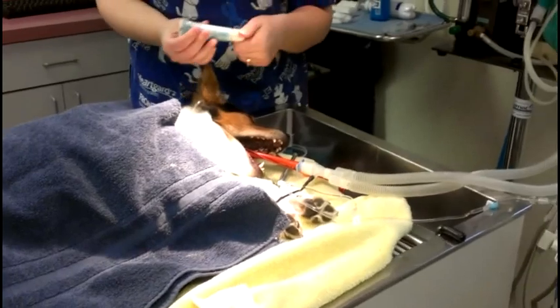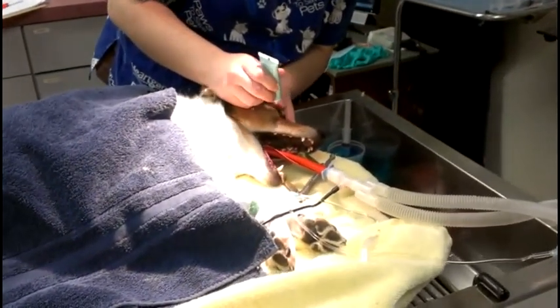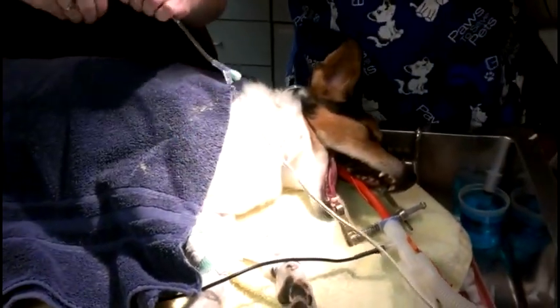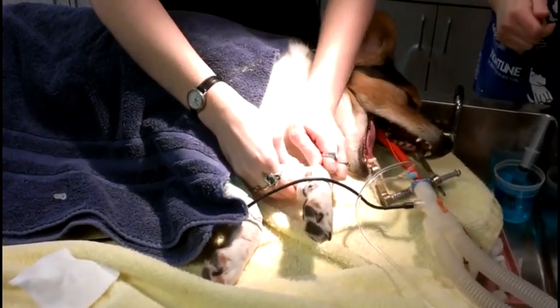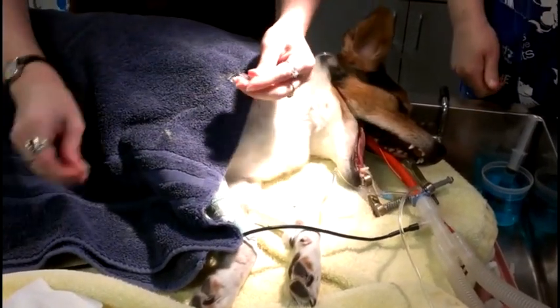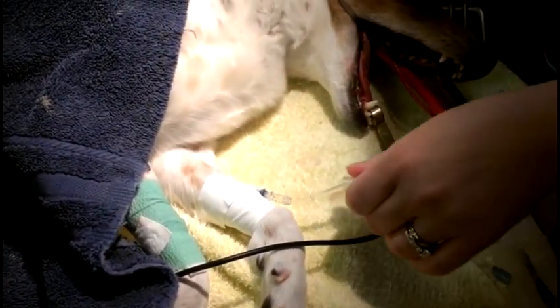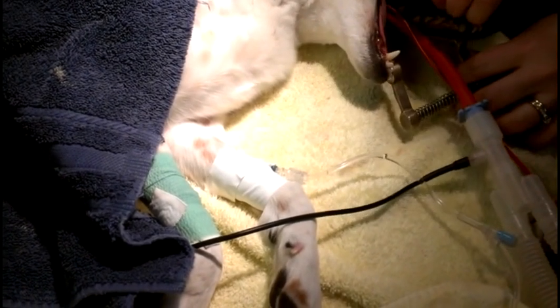Since she doesn't blink while she's under anesthesia, we have some artificial tears ointment. We'll put that in her eyes just to keep her eyes nice and moist since she won't be blinking. The next thing that Dawn is doing is hooking up the IV fluids. And that's just going to keep her hydrated and keep her blood pressure up while she's under. Gives her a little bit of electrolytes.